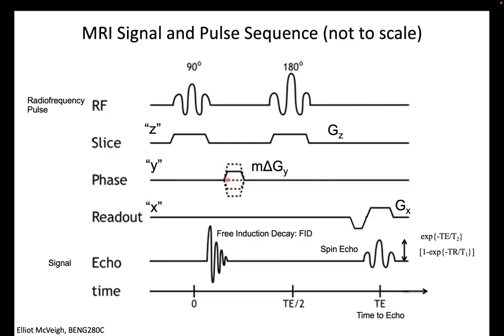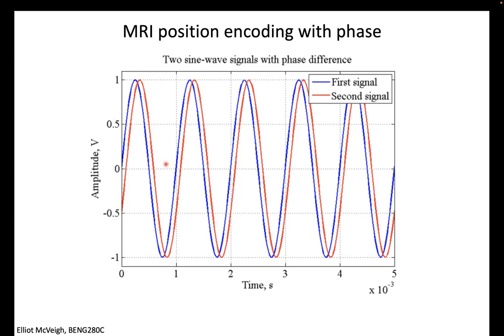I set this thing to 0, right? So we make an acquisition, set this to 0, and ask, well, what is the phase shift of my signal in Y? And it's obviously 0, right? I didn't apply a gradient, so I've got 0 phase shift at the beginning.